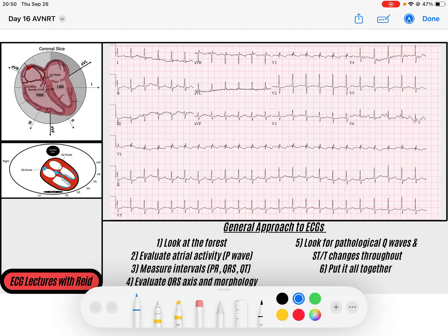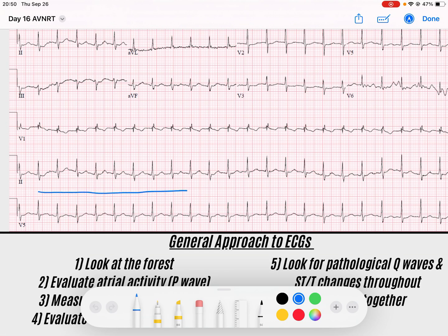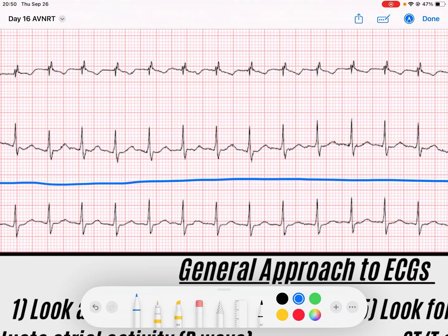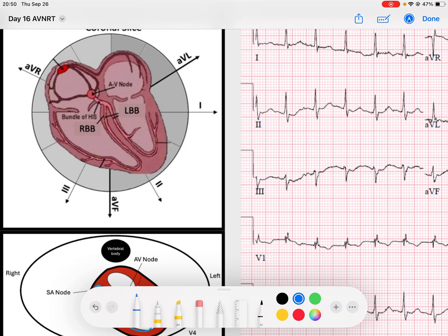The first thing I notice when I look at this rhythm is that I have a very rapid, regular, narrow complex rhythm. If I zoom in, I'll notice that it's a narrow complex rhythm, meaning the QRS duration is less than 120 milliseconds. That tells me those signals are probably coming through the His-Purkinje fibers, causing rapid QRS complexes.